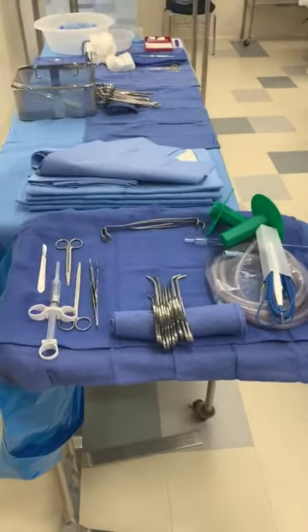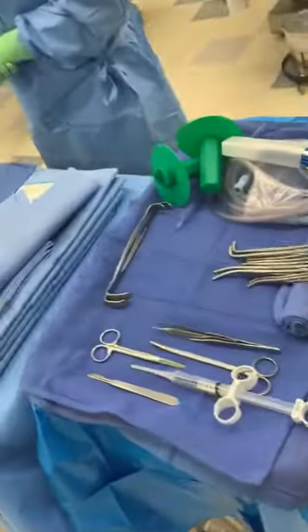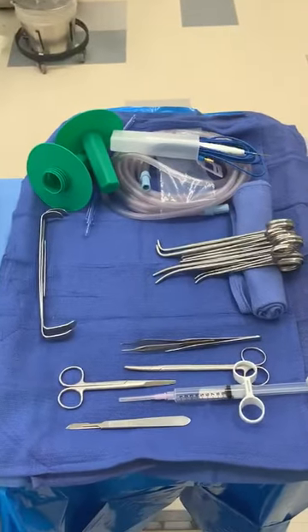This needs to happen in three minutes. This is what your mayo stand will look like as you're facing it.